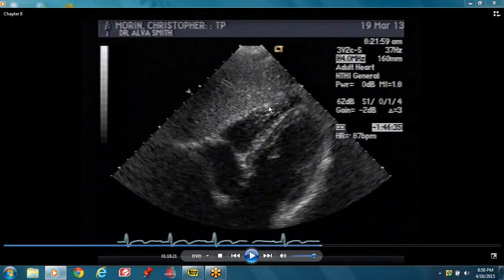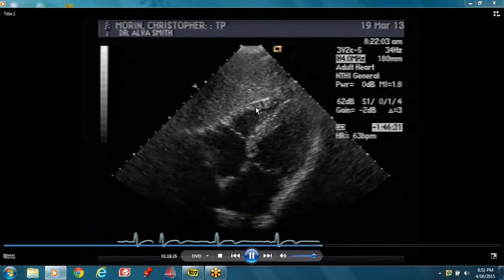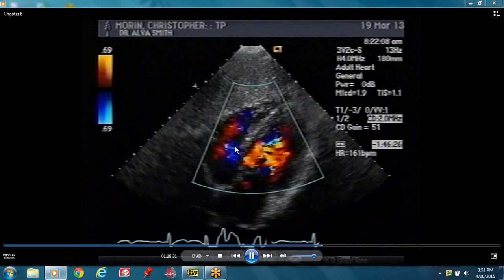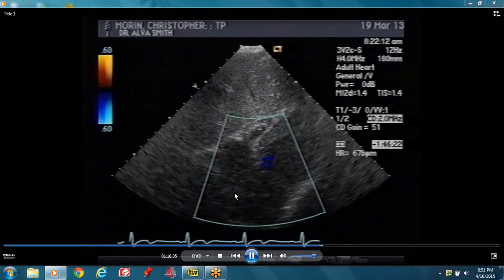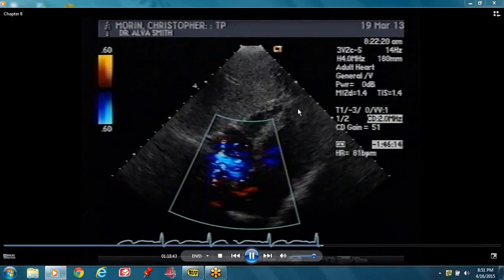The right side of the heart is beside the liver. This is the right ventricle and this is the right atrium — of course your tricuspid valve. This is your interventricular septum, this is the left ventricle, left atrium, mitral valve. This is the view if you're going to measure the thickness of the RV. If the RV is thickened, you zoom it up and measure it. Also a very good view to look at the interatrial septum — if there are atrial septal defects and also the ventricular septum.